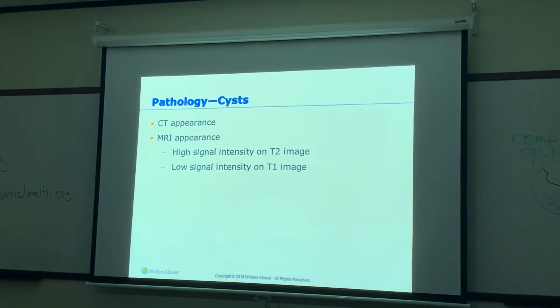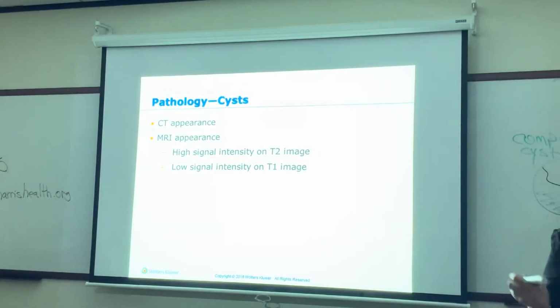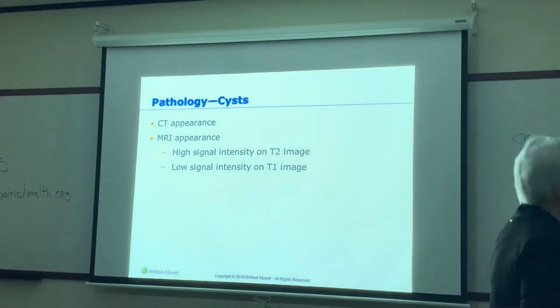Yes, it's in the cervix. Hemorrhagic and chocolate cysts are different, but it looks exactly like a chocolate cyst, because that's what a chocolate cyst is. It's a bloody cyst. Does a hemorrhagic cyst also have posterior enhancement? Correct, it does.